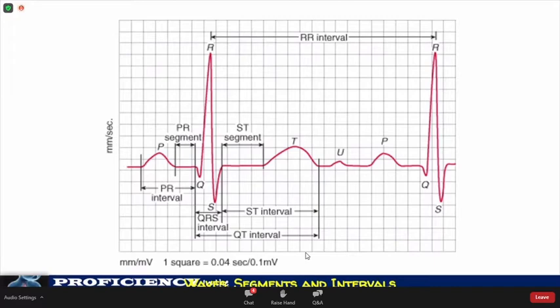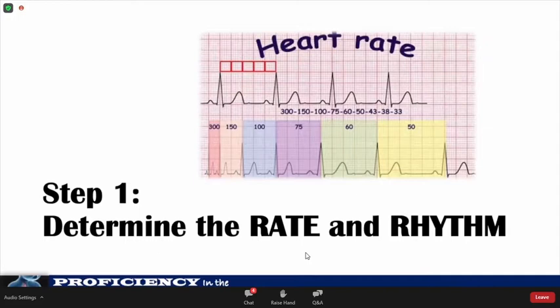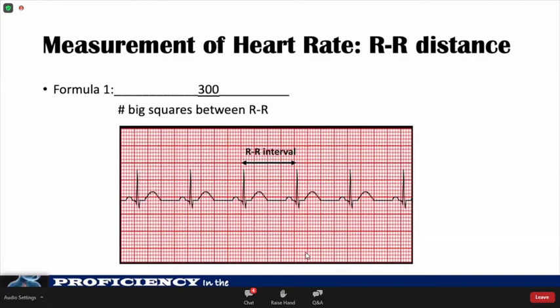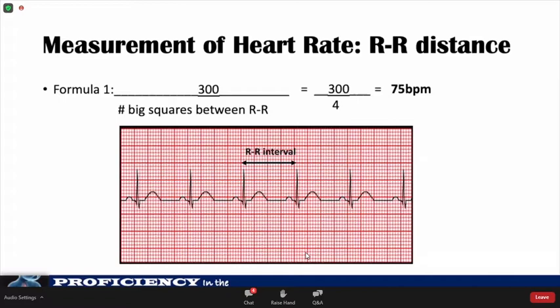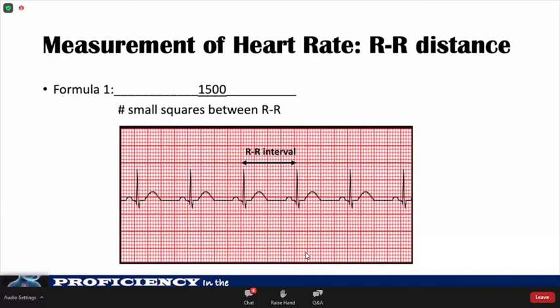Let's now go to the first step: determine the rate and rhythm. There are different ways to figure out the patient's heart rate from the ECG. The mathematical way involves counting the number of large boxes between consecutive QRS complexes and dividing 300 by that number. For example, dividing 300 by 4 gives an estimated heart rate of 75 beats per minute. Another way is to divide 1,500 by the number of small squares between each QRS complex — for example, dividing 1,500 by 20 also gives 75 beats per minute.